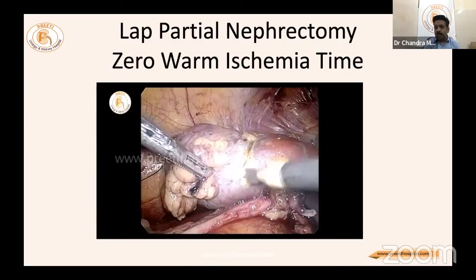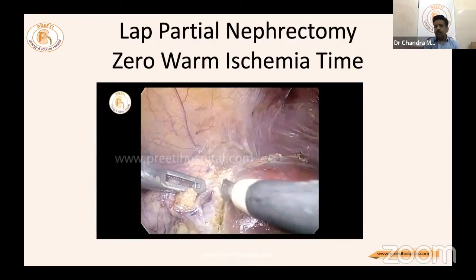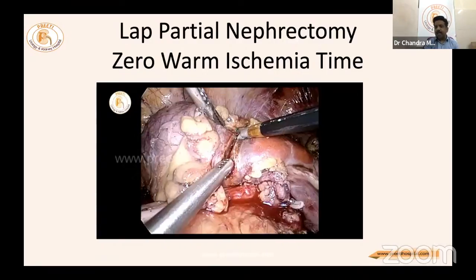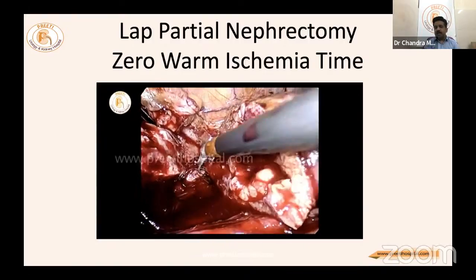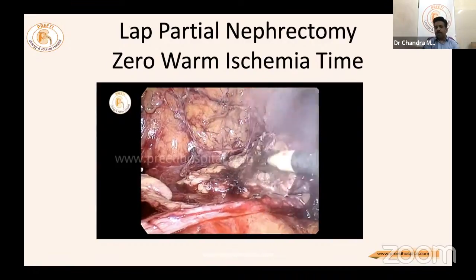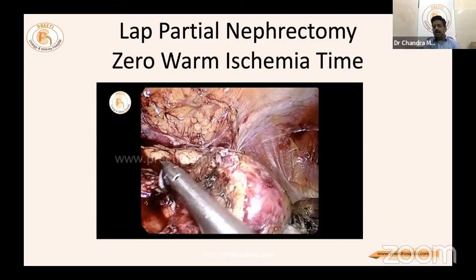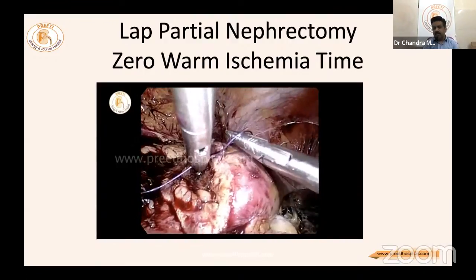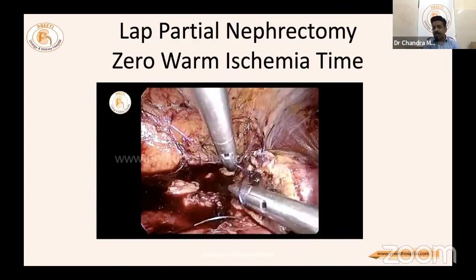The surgeon was very happy not to clamp the renal artery for this elderly lady, since her creatinine was elevated. In elderly patients, sudden deterioration of renal function is a concern. This becomes a good indication for partial hemi nephrectomy — creatinine 1.6, diabetic hypertension, and clearly only the lower pole involved. With zero warm ischemia time, suturing of the PCS and inner layer can be done in unlimited time using a ureteric catheter for guidance.